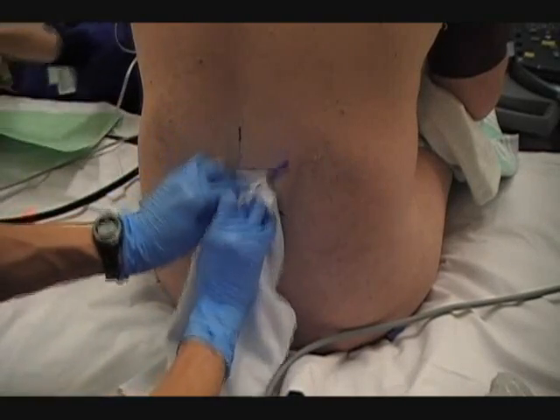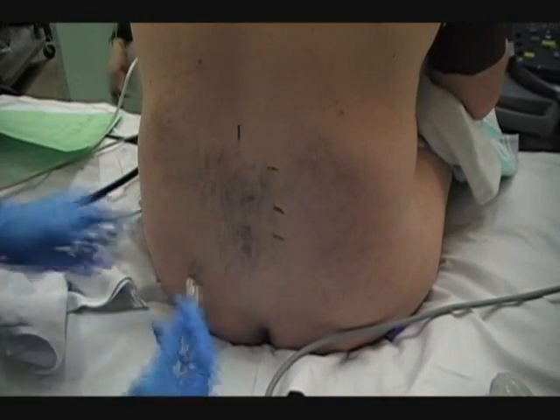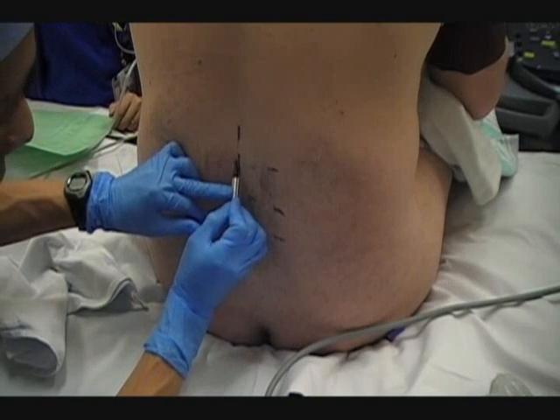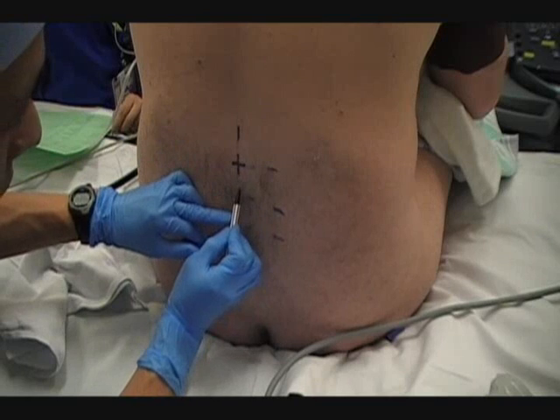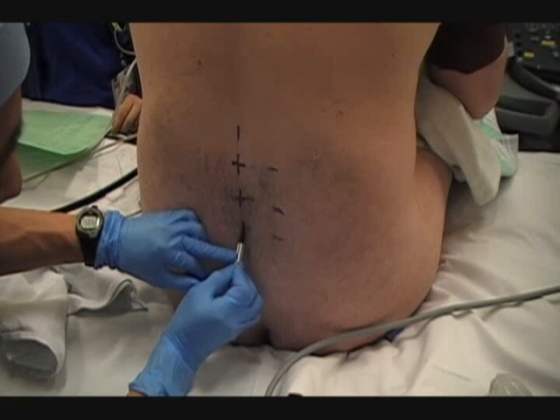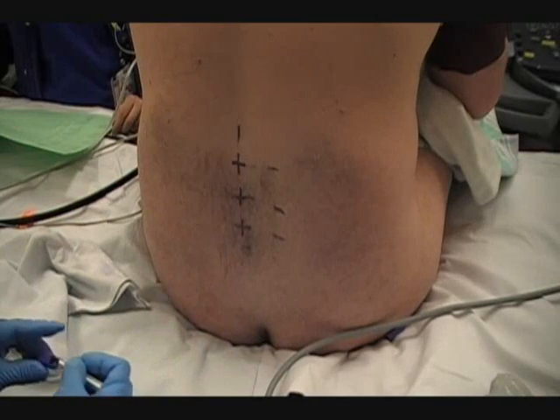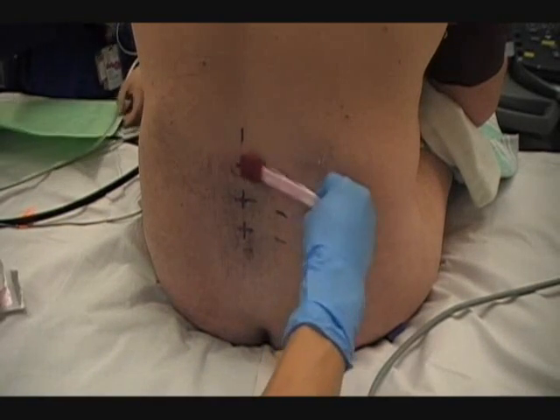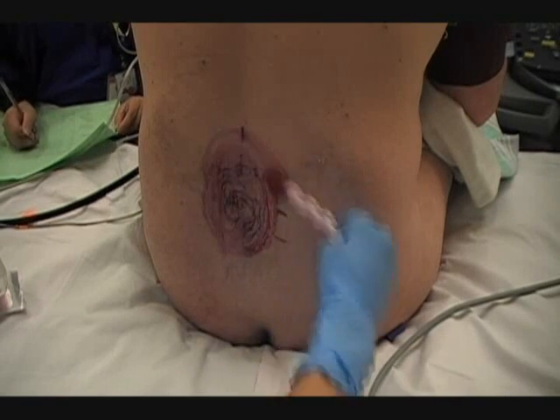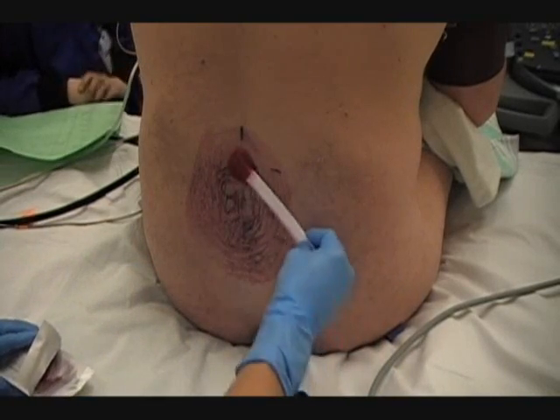The gel should now be cleaned off thoroughly. The lines marking the location of the neuraxial midline and the interlaminar space can be extended to intersect, which indicates the insertion point for the spinal or epidural needle. The operator should be aware that error in marking can occur, particularly from skin movement, and they should compensate accordingly. Careful skin preparation preserves the markings. The needle insertion points can also be marked by indenting the skin with the hub or cap of a needle.